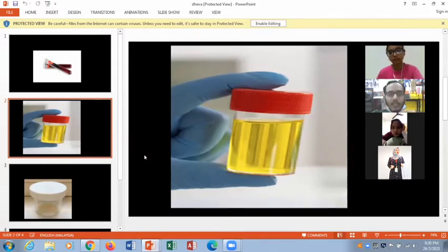The container should have a secure closure to prevent specimen loss and protect the specimen from contamination. It should be compatible with the automated systems and instruments used in the lab. The container should also be compatible with the pneumatic tube system if one is used for urine specimen transport in the facility. A leak-proof device in this situation is critical.